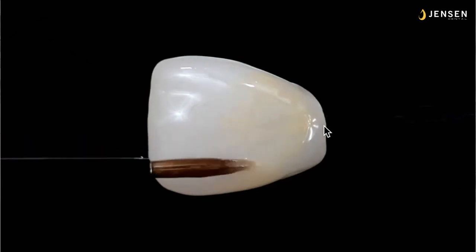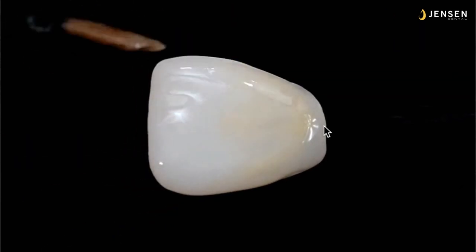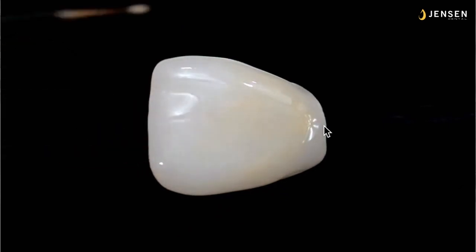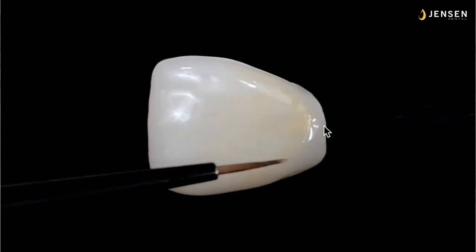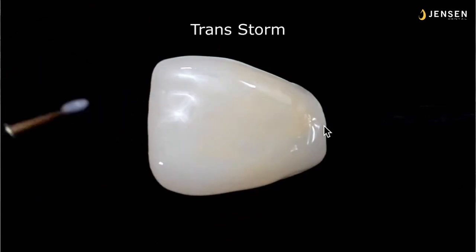You can always add a little bit more if you want to, or you can go down to a smaller brush to pull color in certain areas if you miss it. Sometimes I'll go to the MiYO 1 brush, which is like a 5-0 type brush. There's the MiYO 1 brush right there. So I can do this now very parallel. At the very most, I'm probably 5 or 10 degrees. But the more close to parallel you are, the easier it'll be.